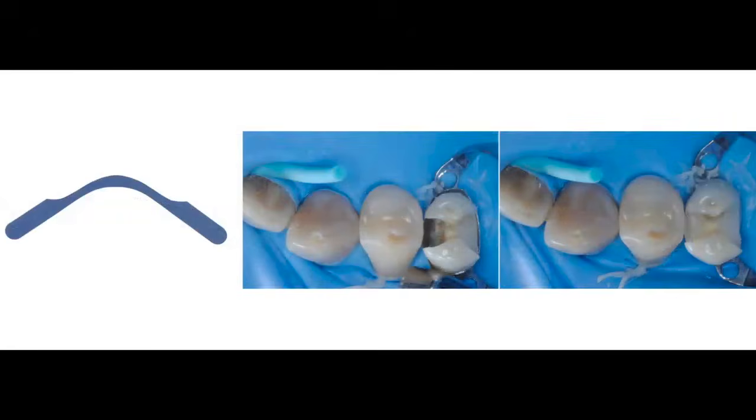And this band actually comes in two different presentations. You can buy it the way that you see it right here on the left-hand side. There are many companies that make them out there. This one specifically is made by Garrison, but there are a lot of other companies that make this type of deep margin elevation modified Tofflemire band that can still be used on a regular Tofflemire band holder. But Garrison also makes one that comes with a special tool that you have to rotate so that the band can be tightened around the tooth. So this would be a retainer-less system.